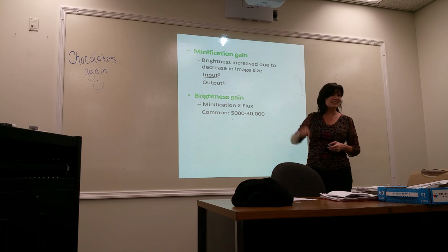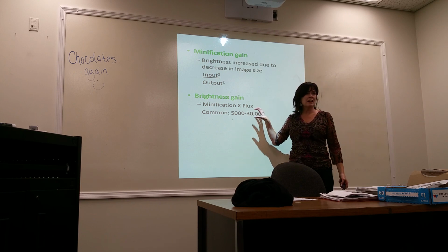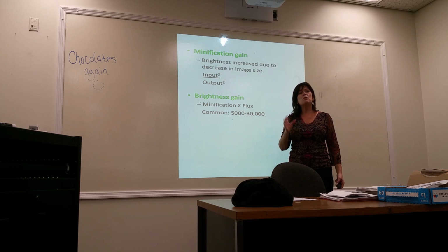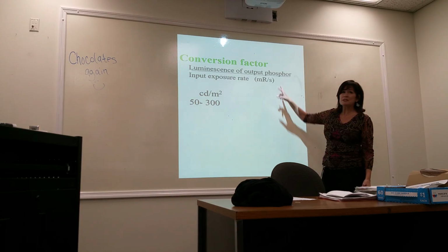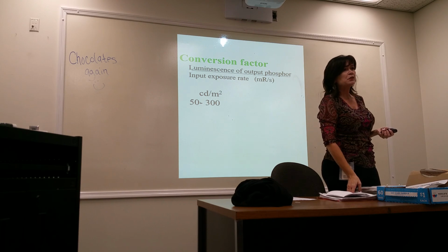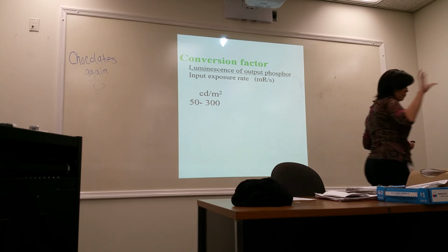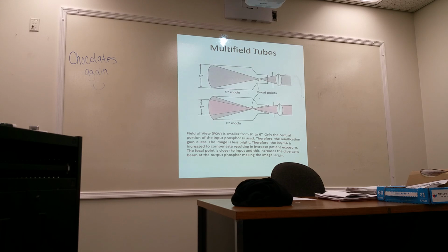What causes any of this? What do you start out with? X-rays. So I can make this one brighter by doing what? Increasing the amount of X-rays. So what you really want to know is the conversion factor. How much X-ray energy does it take to make that light energy? Right? Isn't that what you really want to know? That's the ultimate. Because we can all make our image intensifiers as bright as they can be by increasing the mA.